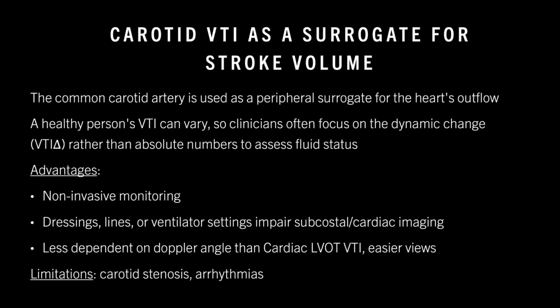So the common carotid artery is used as our peripheral surrogate for the heart's outflow. And just of note, a healthy person's VTI can vary. So we're going to focus on the dynamic change, or the delta VTI, rather than absolute numbers to assess the fluid status. Again, we're tracking this change over time after a physiologic manipulation.